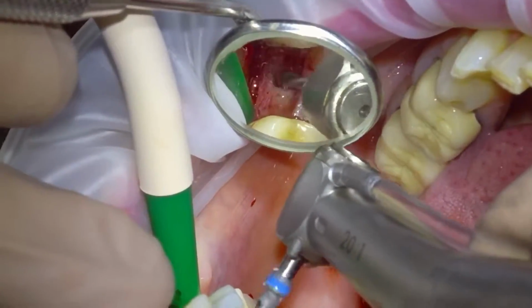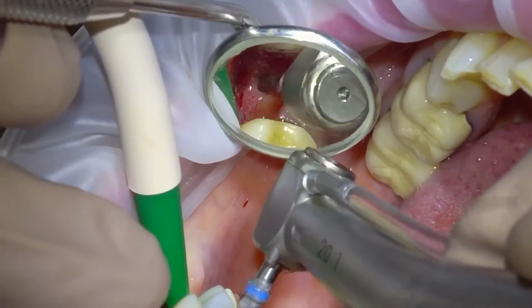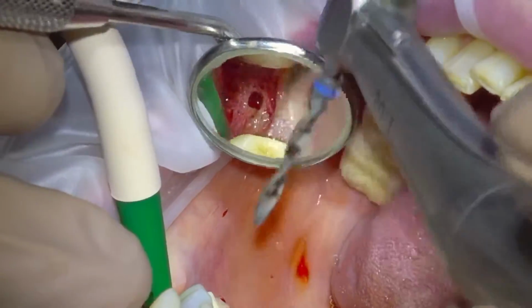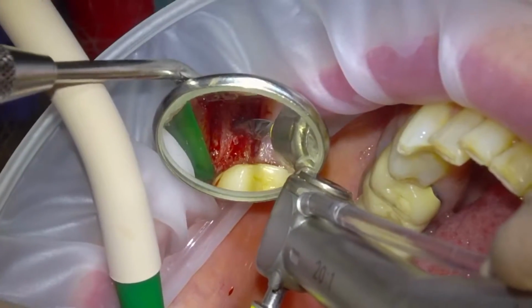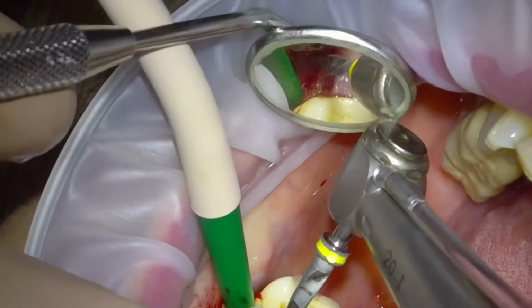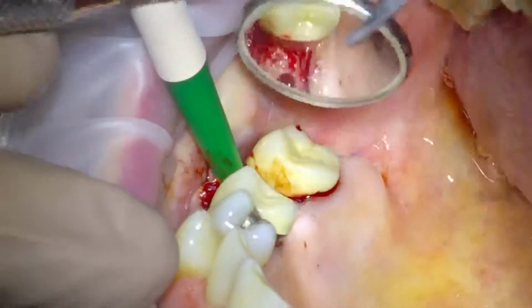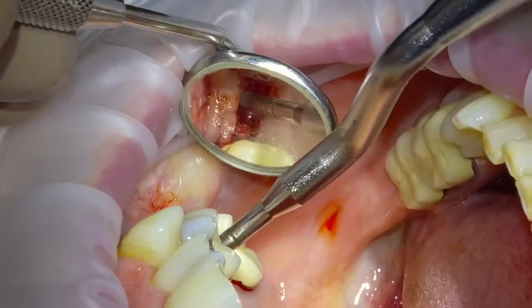And so now I'm going to go to full depth. This is going to be an 8mm fixture with a small little Summers lift. And then the next drill sequence, just to widen the osteotomy site. Again at slightly slower RPM, 600 RPM.